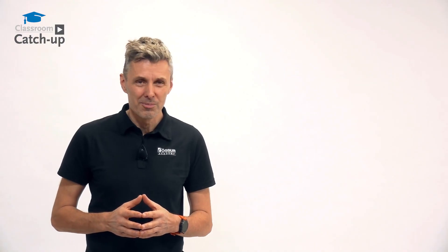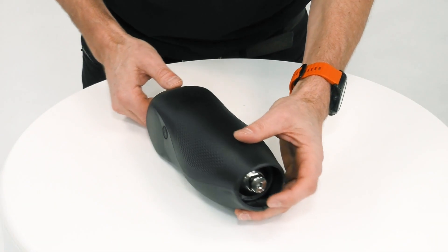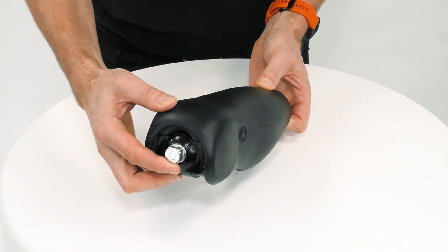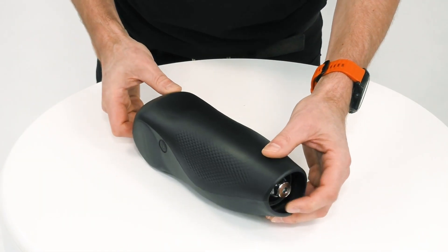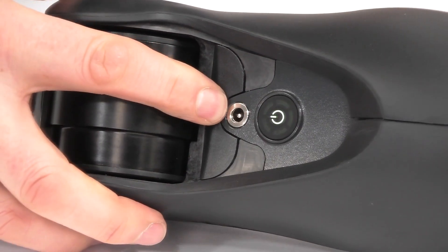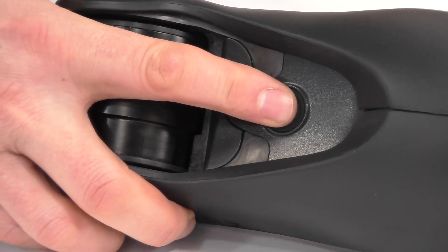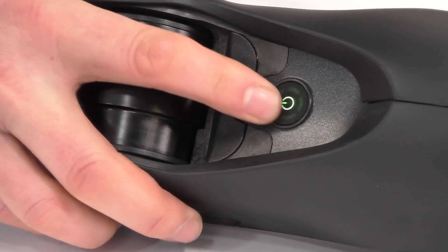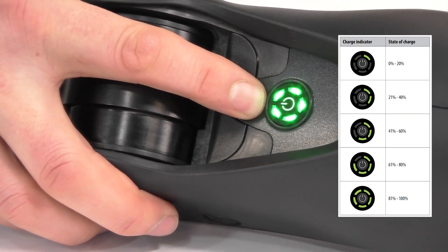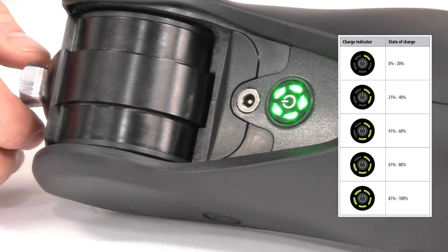Let's take a closer look. Here we can see the complete NAVI, with both distal and proximal male pyramid connectivity. When we turn the knee over, we can see a waterproof charging port and a single press on/off button. An extended press also doubles as a battery level indicator, and low-level battery warnings are given both audibly and through vibration.